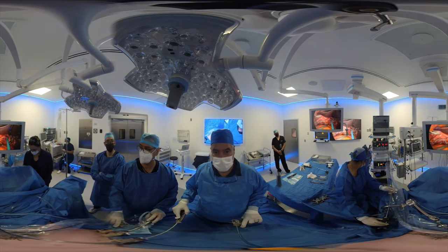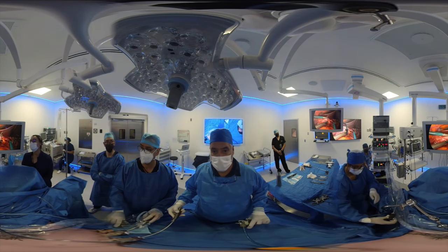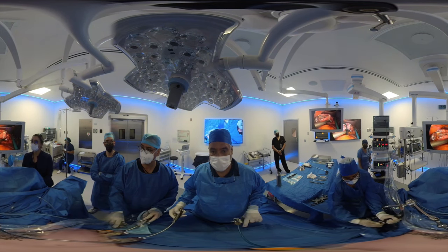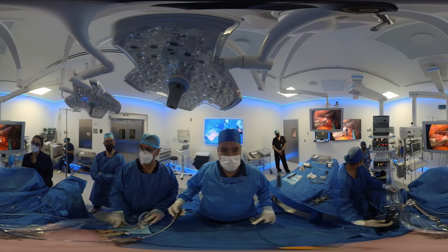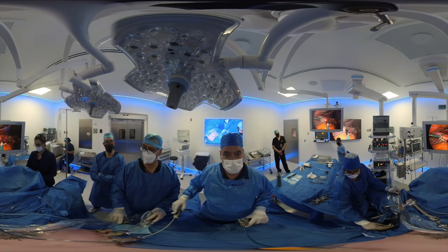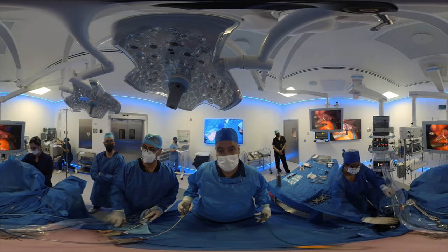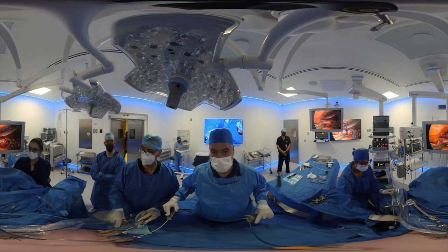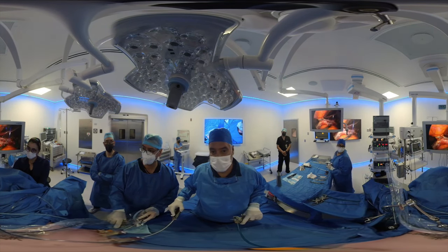You can scroll around anywhere. You can see my anesthesiologist removing the calibration tube partially. One of the things you don't want to do is bury the staple line — you don't want to pinch it. We're about to come up to the last few stitches. We've been in here for around 20 minutes from the start, and we're going to ask my anesthesiologist in just a couple of seconds to remove the calibration tube. We've got a few more stitches to go.